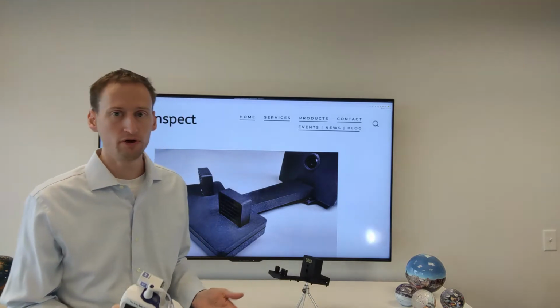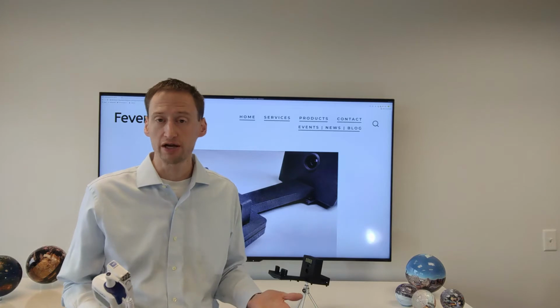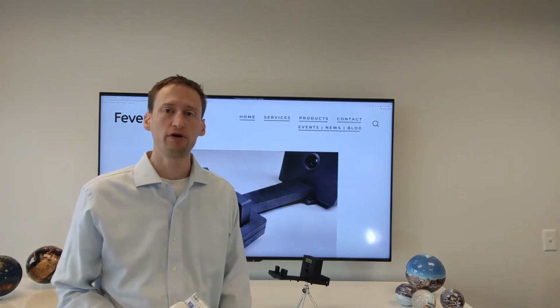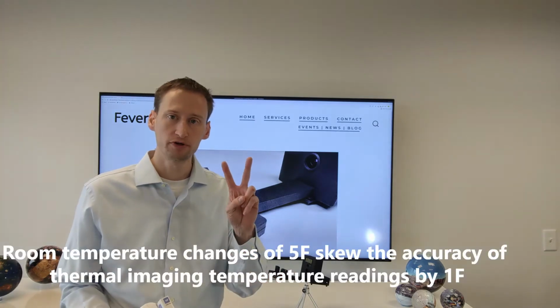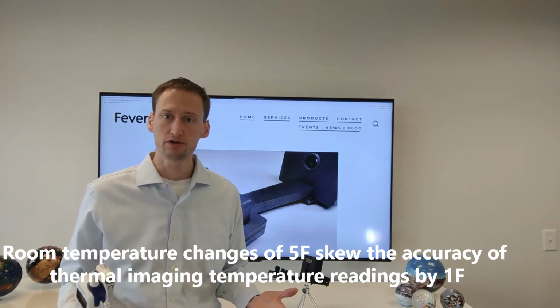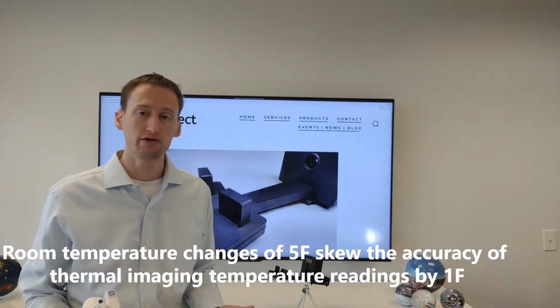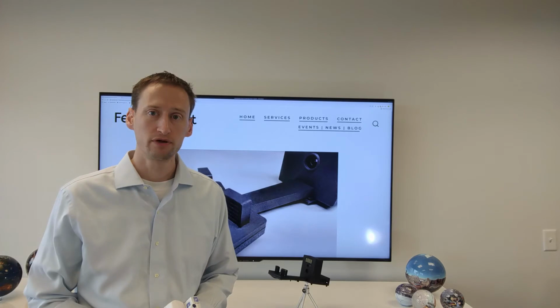What will happen in a school, though, is the doors will open up, kids will start coming in, and the temperature could decline or change. If it declines by 10 degrees, it will then start underreporting core body temperatures or oral temperature surrogates by 2 whole degrees. You're not using a system that provides any sense of safety, because it's underreporting, simply because it's not tracking and then correcting for the air temperature change.